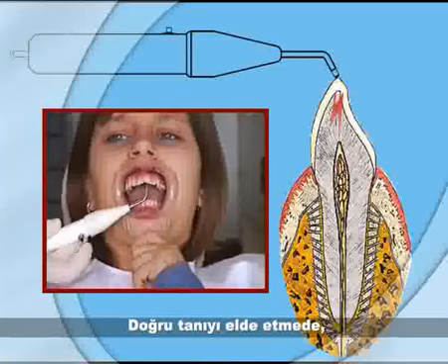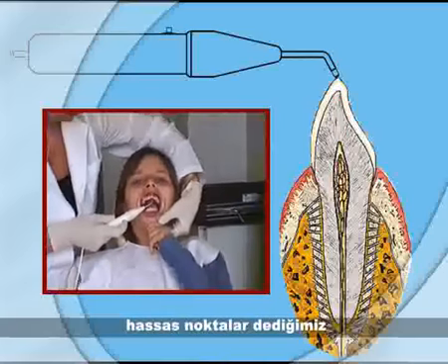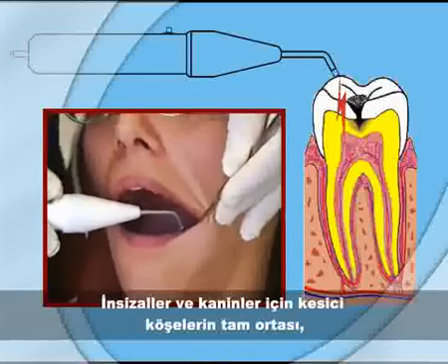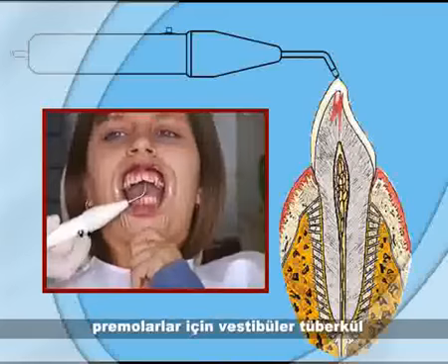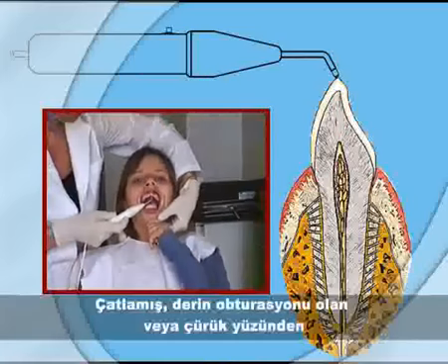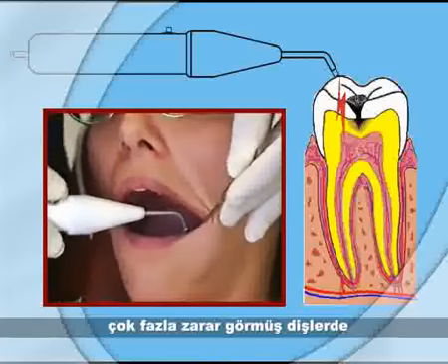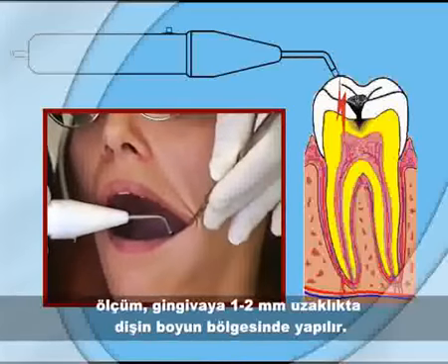The place where the electrode contacts the tooth, the so-called sensitive point, is exceptionally important for correct diagnostics. For the incisors and canines, the sensitive point is in the middle of the cutting edge. For premolars, it is the vestibular tubercle, and for the molars, the mesovestibular tubercle. For teeth with fracture, big obturations or extensive destruction by caries, the examination can be done in the tooth neck area, 1 to 2 millimeters over the gingival edge.